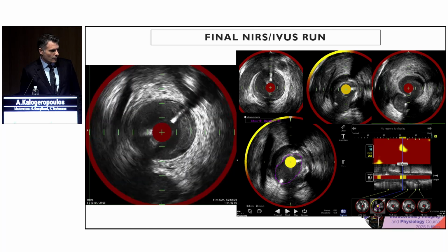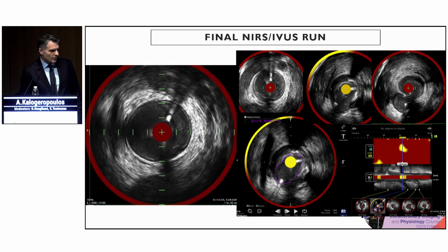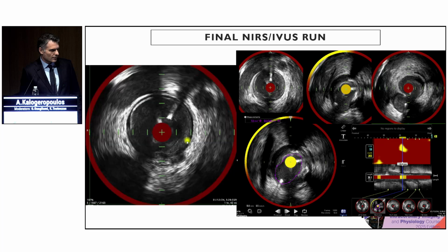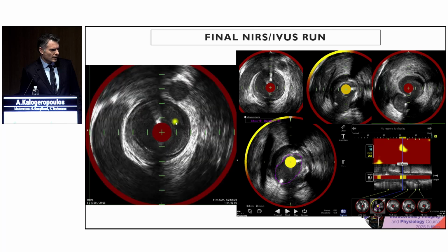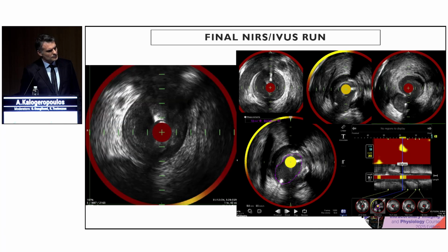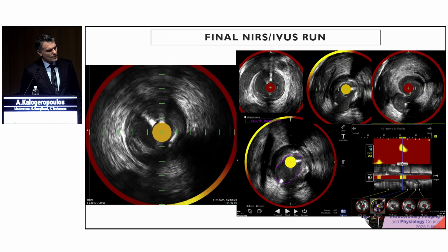Medial dissection means hematoma, and we'll see in a bit. Here you can see the incision at the 4 o'clock. And then before there was a black contour going around, so the lumen was, and again here, clearly improved. But then we will discuss the hematoma.